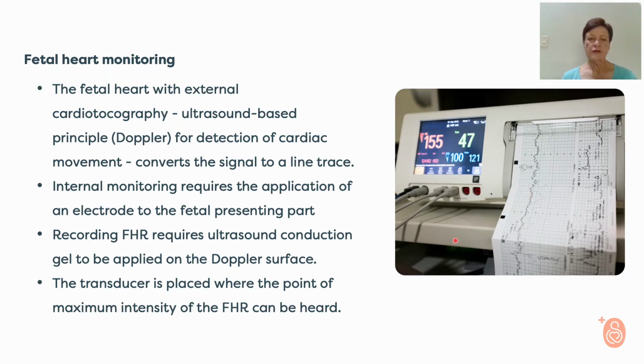We can do it both externally and internally. The photo that you've seen on the previous slide is obviously the external method of doing the CTG, and I will show you the internal part just now, where we require an electrode that does basically exactly the same, also works on an ultrasound-based principle, and it also relays the fetal heart to a graph.